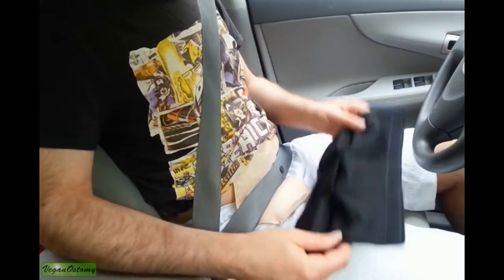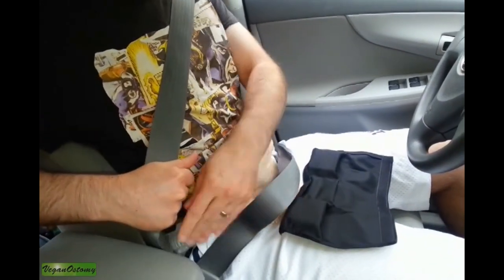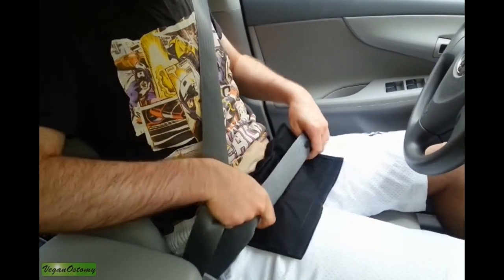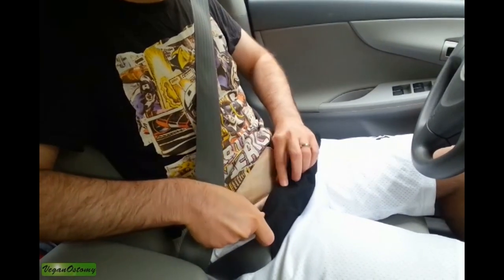This product essentially aims to protect the stoma from any impact and really just makes your drive a lot more comfortable. I'll explain how it goes on — basically what I like to do is just put the seat belt in place and slip this underneath.